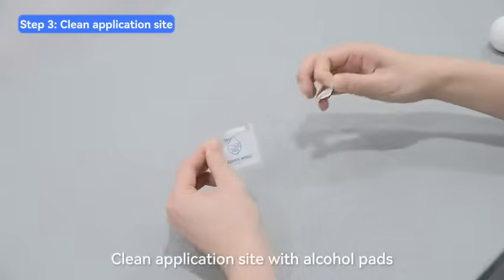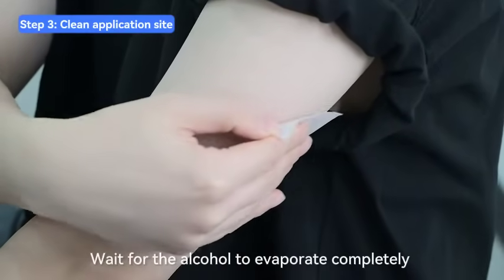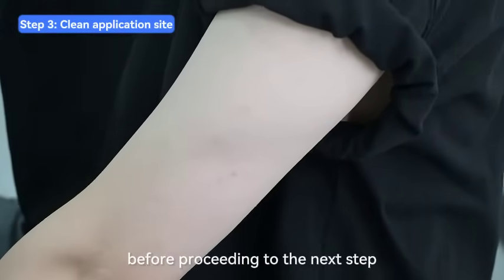Clean the application site with alcohol pads. Ensure that the selected area is clean and dry. Wait for the alcohol to evaporate completely before proceeding to the next step.